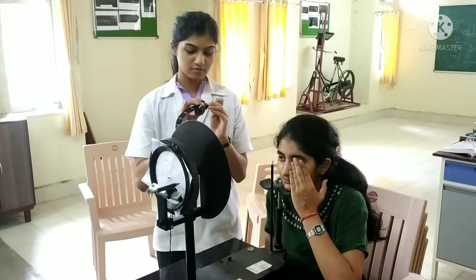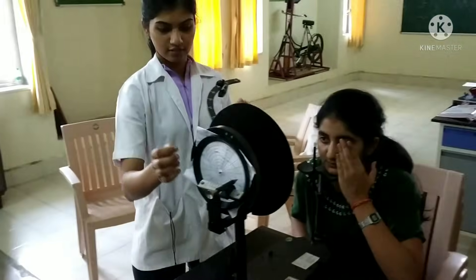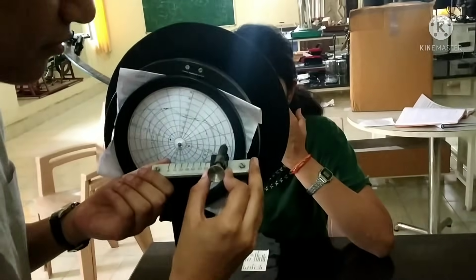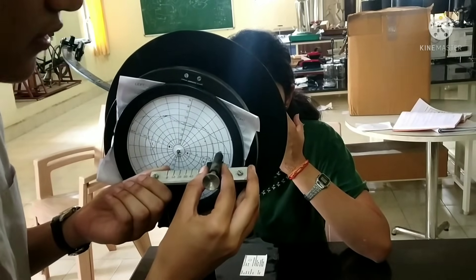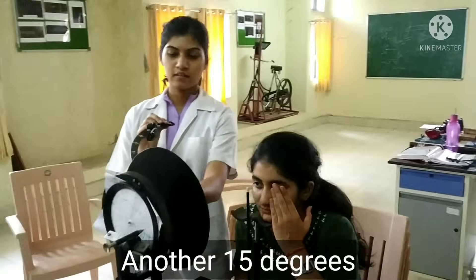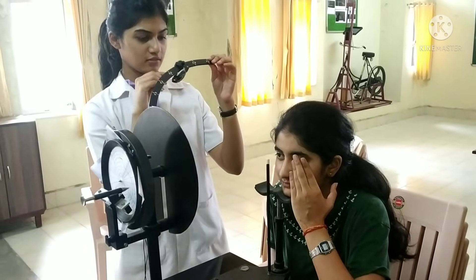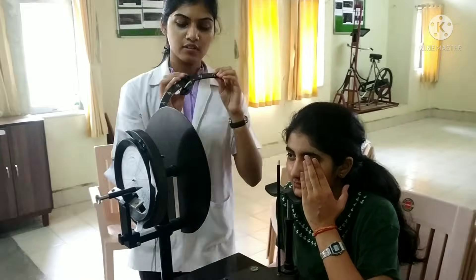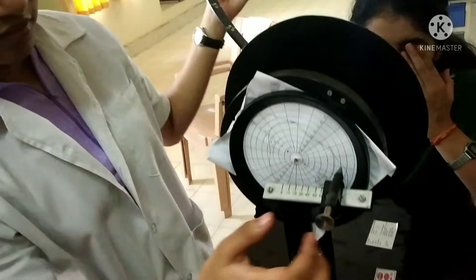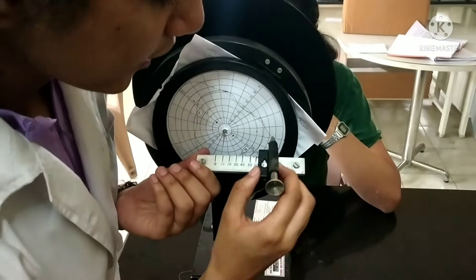Moving the object at approximately 15-degree intervals from periphery towards centre, the next reading is 75, which we mark on the chart. At the next 15-degree interval, the reading is 70, and we mark that point as well.